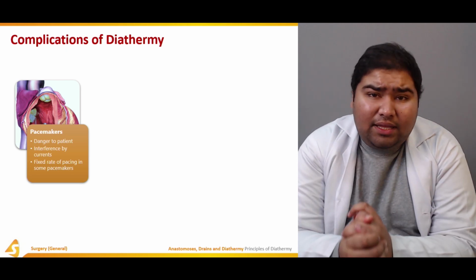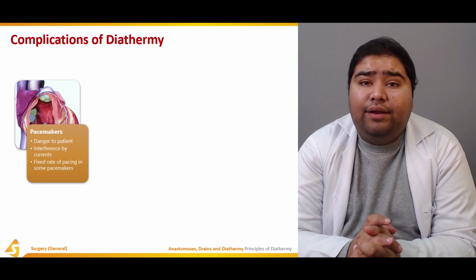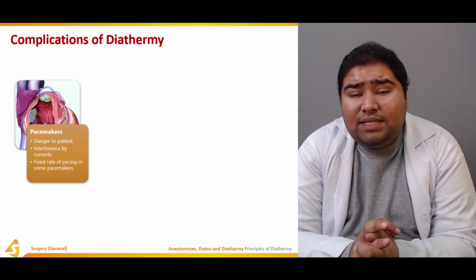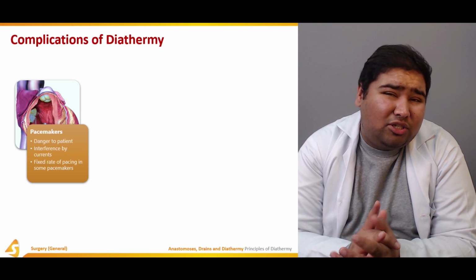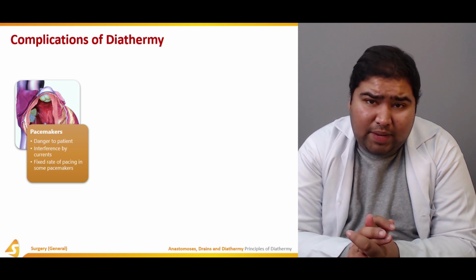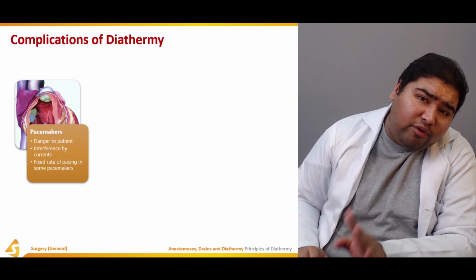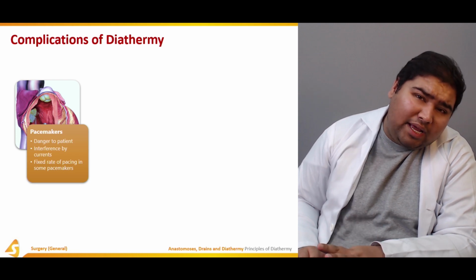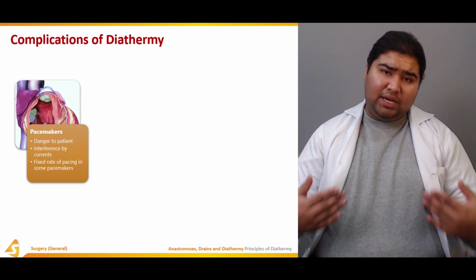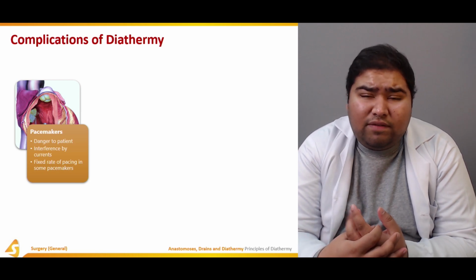Now, another important aspect, the pacemakers. Pacemakers are electrical devices, and in diathermy we're using electricity. So diathermy can jumpstart, not exactly jumpstart, your patient is already on a pacemaker and that is working perfectly fine. It can affect the function of your pacemaker. So while using diathermy with the pacemaker, try to use it as far away from the heart as possible so that the pacemaker current would not be affected. However, there are some pacemakers which have the ability to reboot themselves if there is some electrical shock or interference to them.